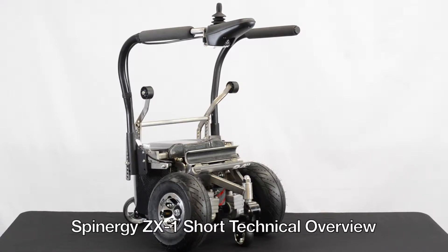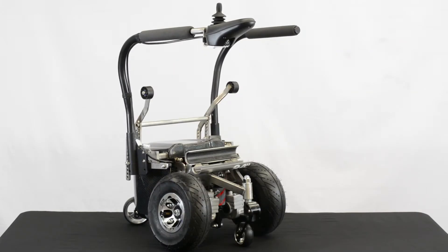This video will be a technical review of the Spinergy ZX-1 power add-on. The ZX-1 is fully adjustable to fit manual rigid frame wheelchairs with wheel sizes ranging from 24 to 26 inches in diameter.